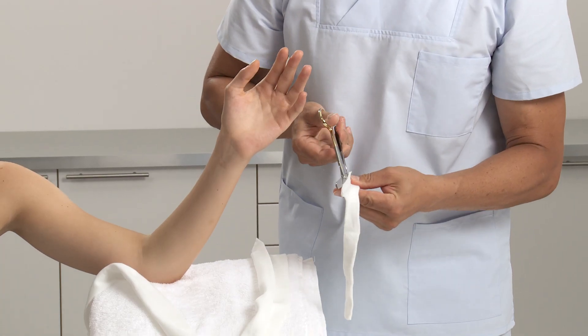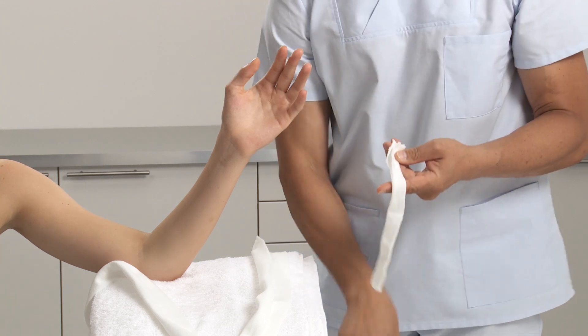Make a cut into the thumb stockinette and slide it over the thumb, smoothing it down.